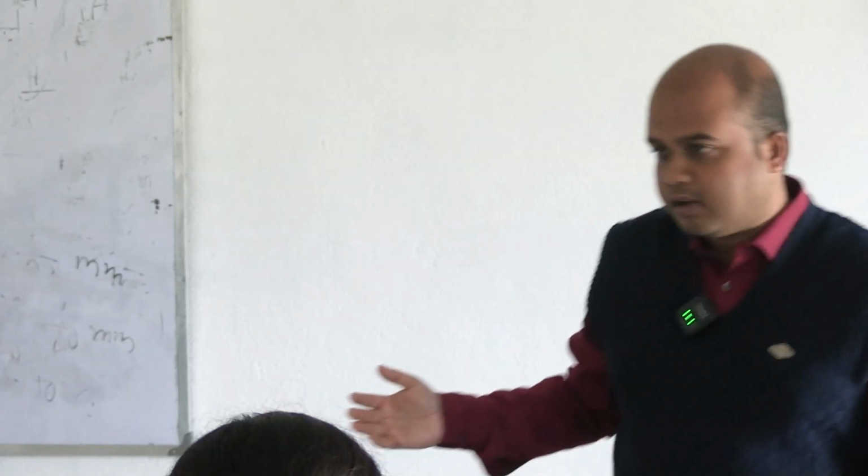After charging, I need to count from the left upper square. So it is better, before taking blood into the pipette, that the focusing is done as it is required for counting.